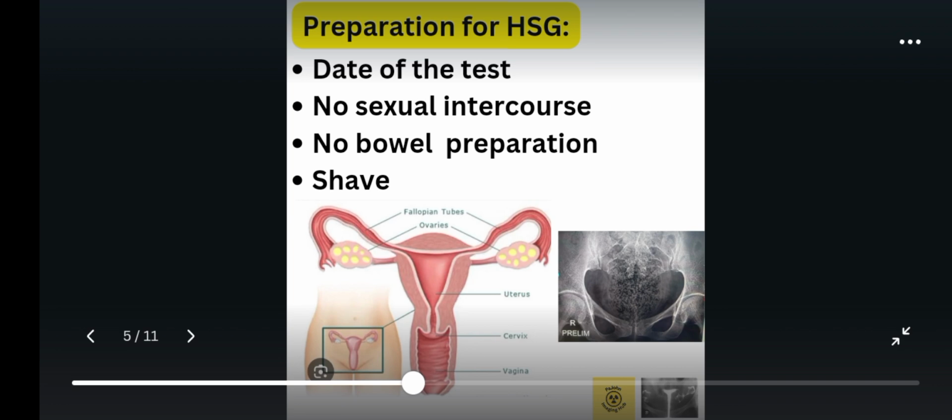For patients that cannot fast, they can eat that morning. But when you come fasting, it makes you to be comfortable, especially during the procedure. But you can eat if you cannot tolerate that fasting for that morning before the procedure. Then patients on medication are advised to eat and take their medication. Food is not contraindicated before HSG. We advise the patient to shave at least 4 to 3 days before the investigation so as to make the surface clean.